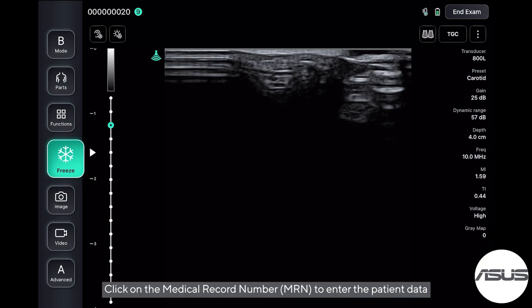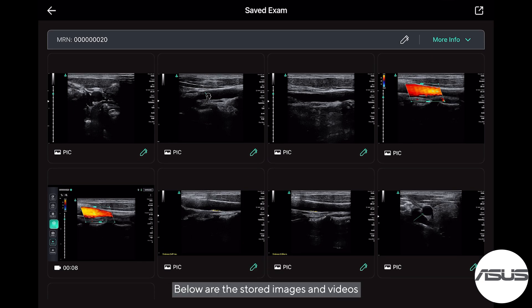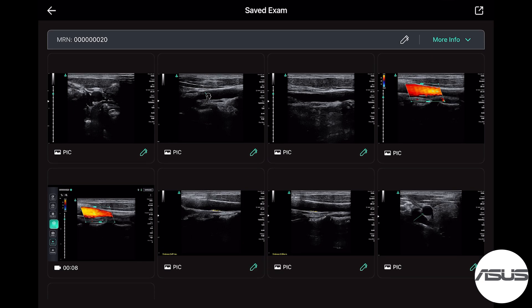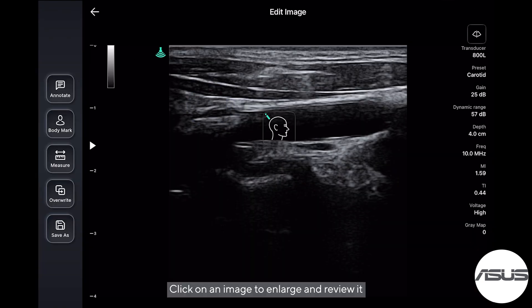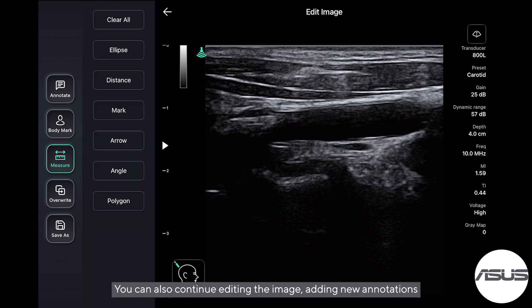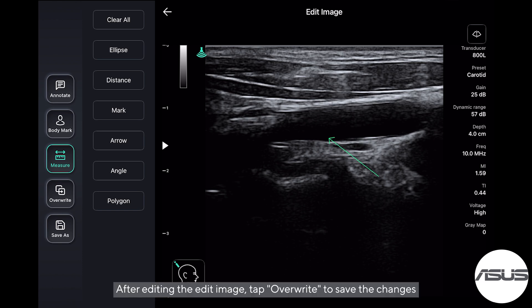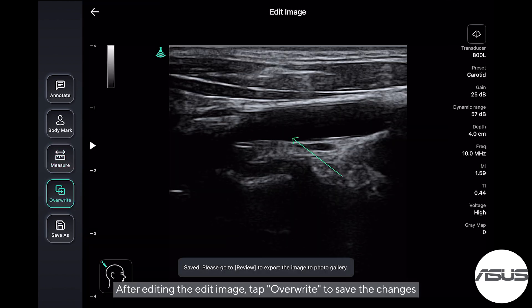Click on the Medical Record Number (MRN) to enter the patient data. Below are the stored images and videos. Click on an image to enlarge and review it. You can also continue editing the image and add new annotations.